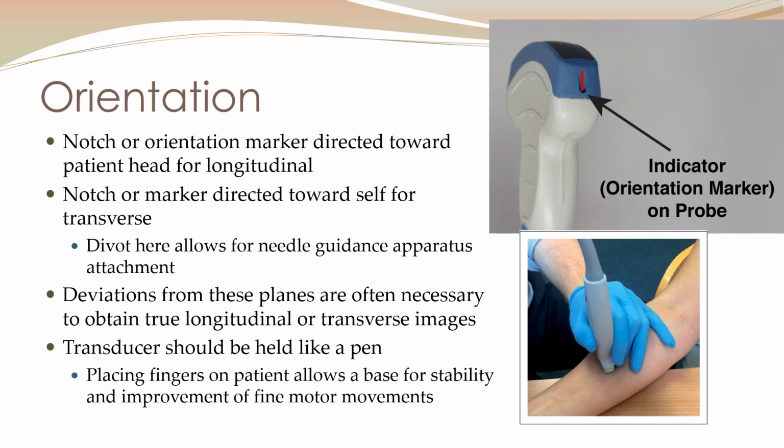So this transducer here has that little canal for the needle. It also has another ridge right here. And when you're utilizing your transducer, you want to make sure that the ridge side of the probe, or the needle side of the probe, is going to be facing towards the patient's head if you're in long, and towards the scanning sonographer or physician or whoever is scanning if they are in transverse or axial. So marks go up towards the head in long, towards yourself in transverse.